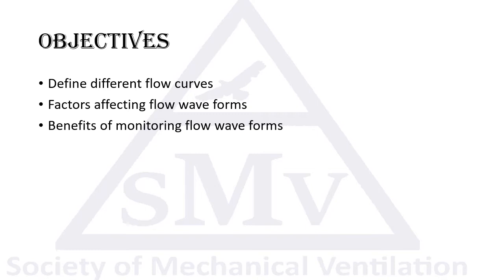Hi, the objectives of our talk today are to define the different flow curves, the factors affecting the flow waveforms, and the benefits of monitoring those flow waveforms. The article here in the picture was published a couple of years ago by our group, where we tried to collect all the information about flow in one place instead of being scattered in the ventilator books and the literature.